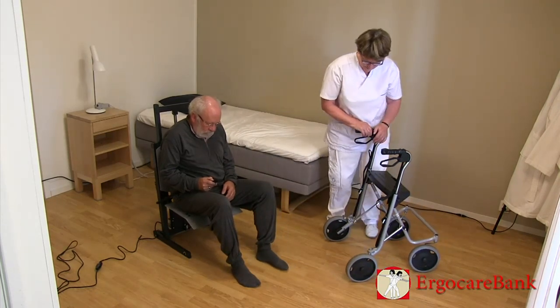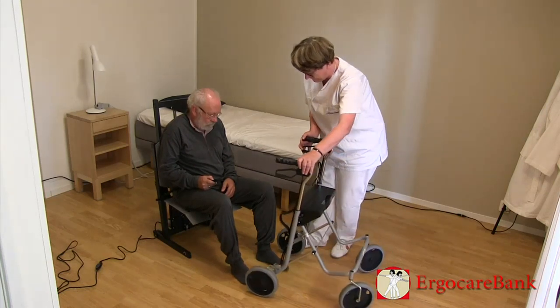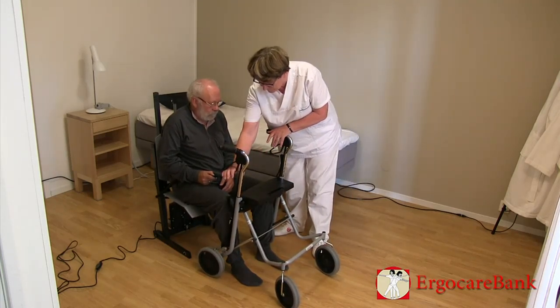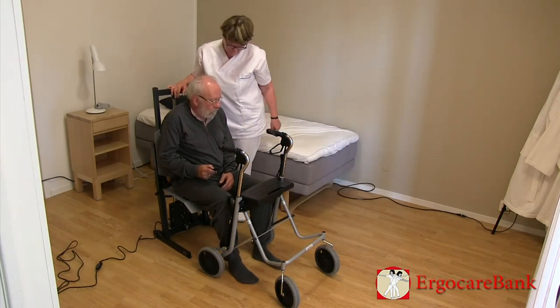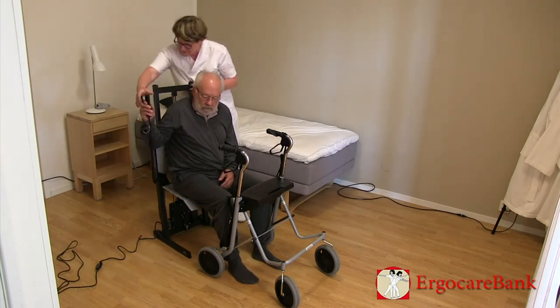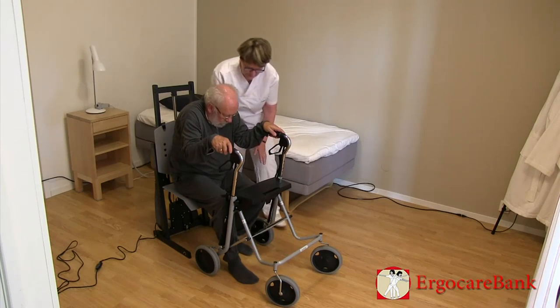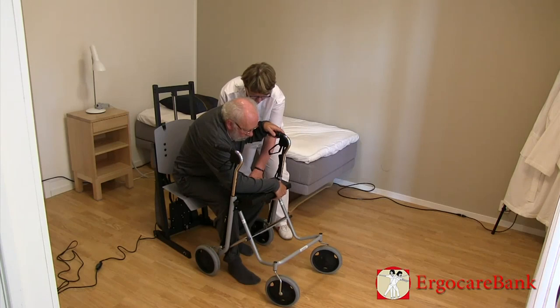The staff member puts Bert's four-wheel walker in front of him. He is instructed to lean on his forearm on the seat of the walker and push himself up to standing.